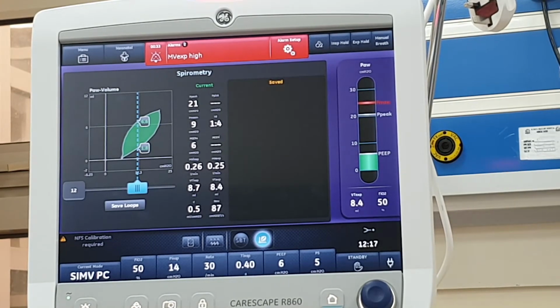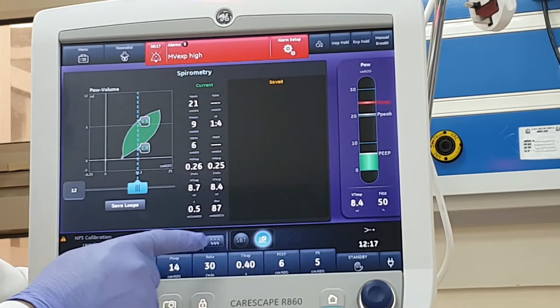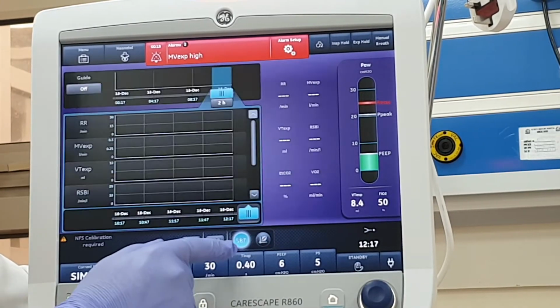We could also do a calibration, touch calibration. So if you are used to touch the screen with the gloves, do the calibration with the gloves, and the other way around. More sensitive. Yeah. Okay. Here is the future.